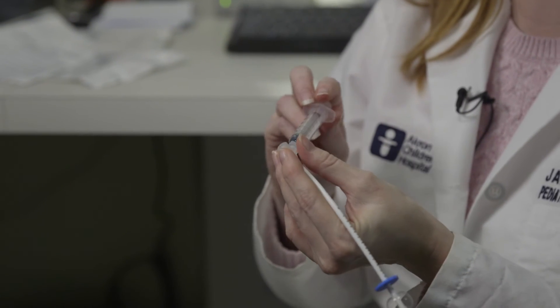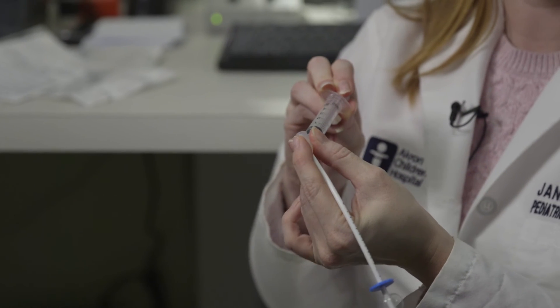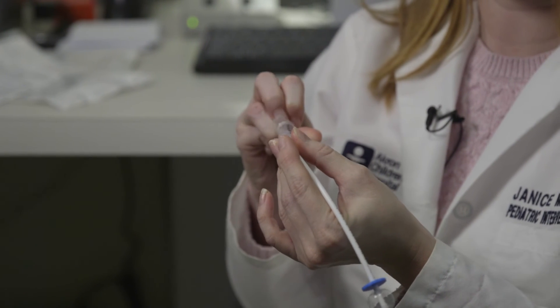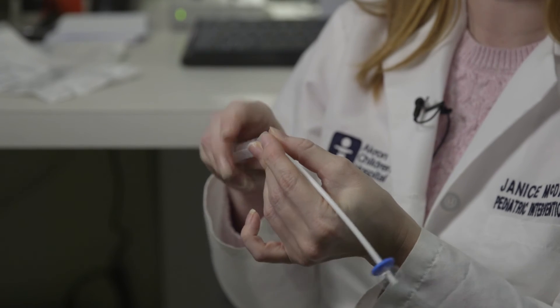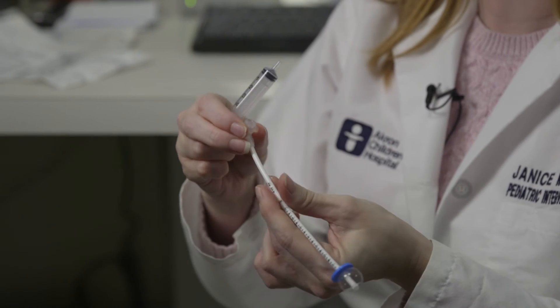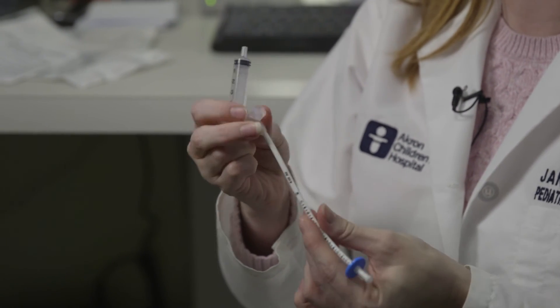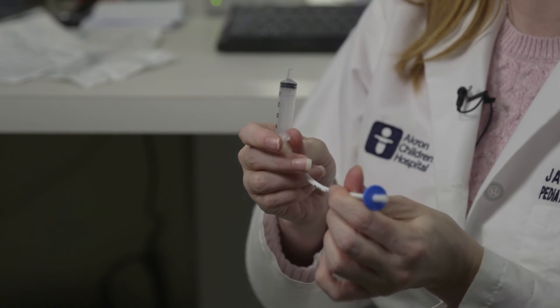When you're done measuring, simply deflate the balloon. You can either do that by putting the slip tip syringe back in and taking the air out, or as an alternative, you can just squeeze the sides of the valve and it will deflate for you.